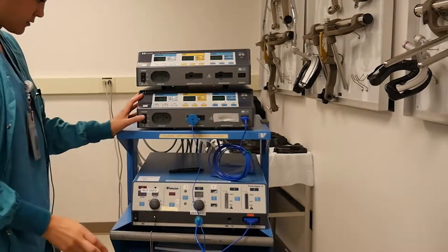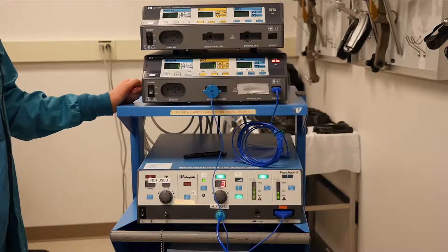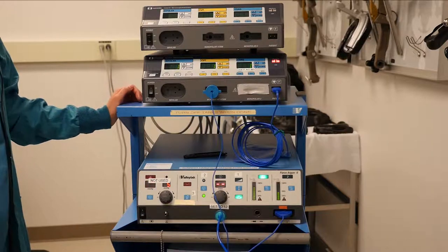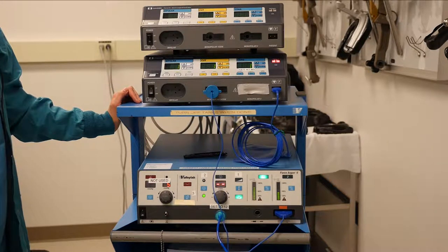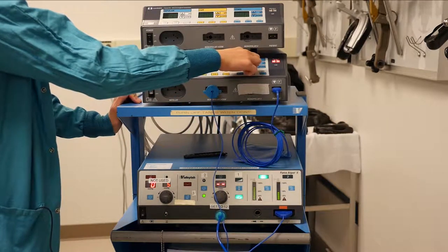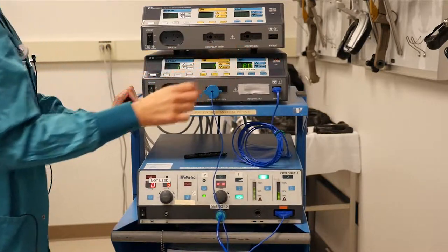Now you can turn on the power. You want to make sure you take your time and let everything turn on completely. You'll set the coag up here to 60, and you can turn it up to 80 if you need to.